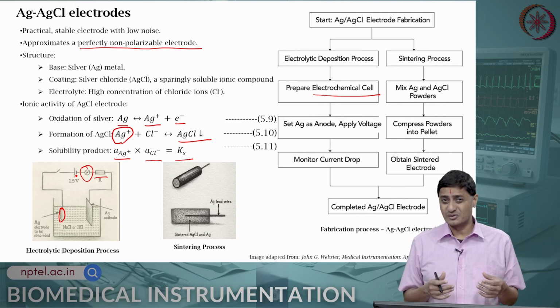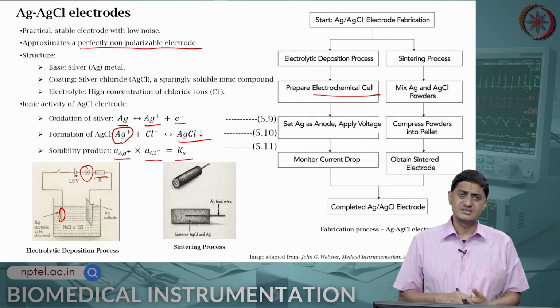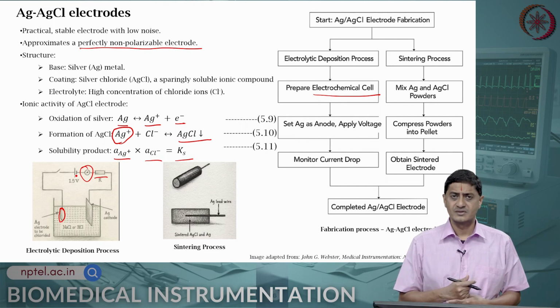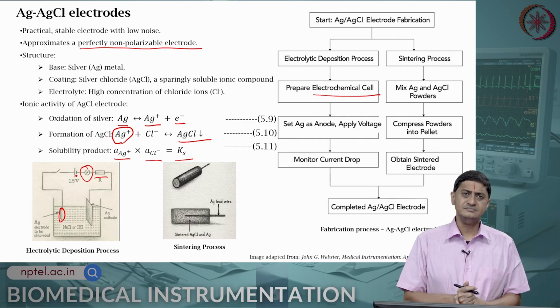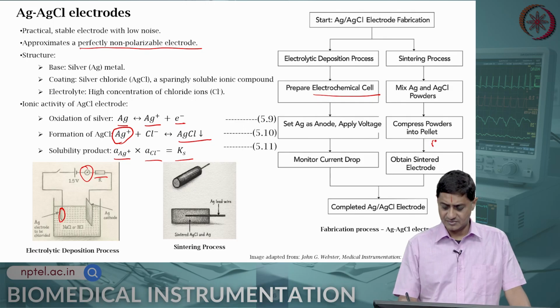They are mixed well so as to ensure relatively uniform mixing of powdered silver and silver chloride salt. And you put this into molds and compress them very tightly with a press, with a lead included, and then you bake them.